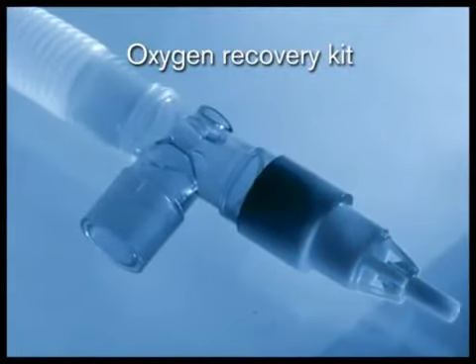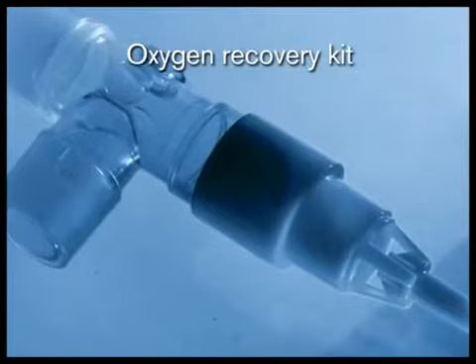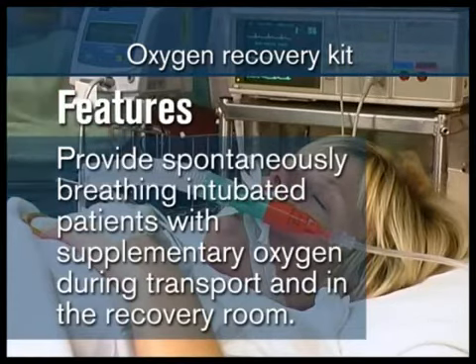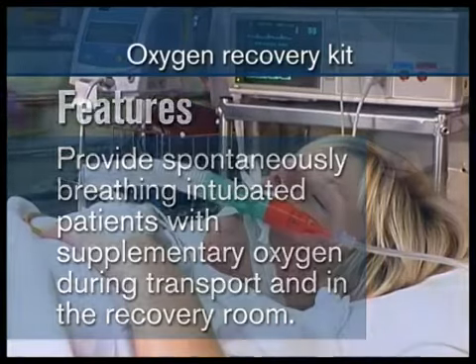Fixed Venturi valves can also be incorporated into oxygen recovery T-piece kits. The most popular is the 40% valve. These are used to provide spontaneously breathing intubated patients with supplementary oxygen during transport and in the recovery room.